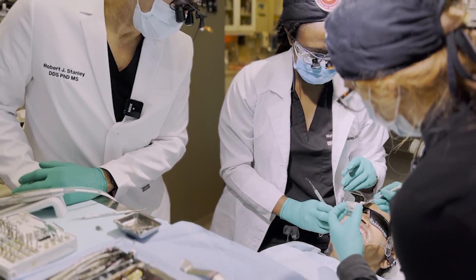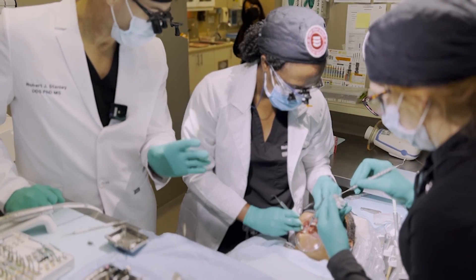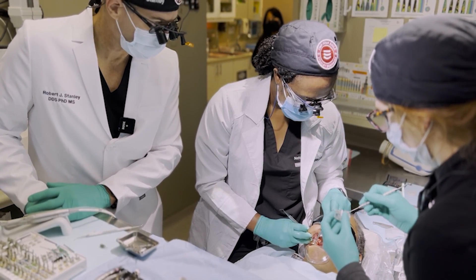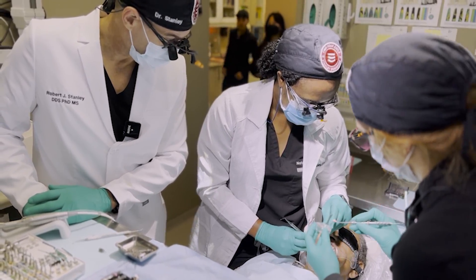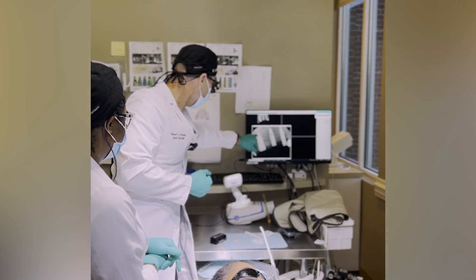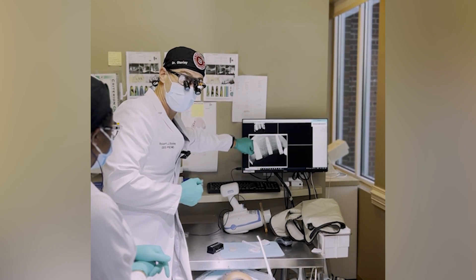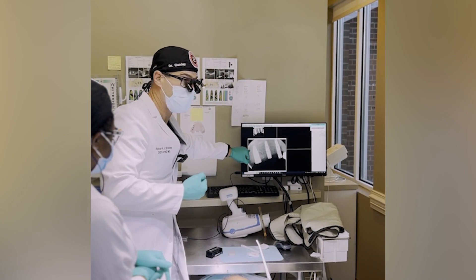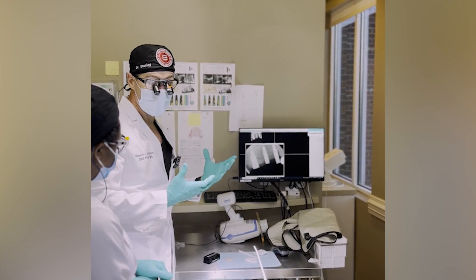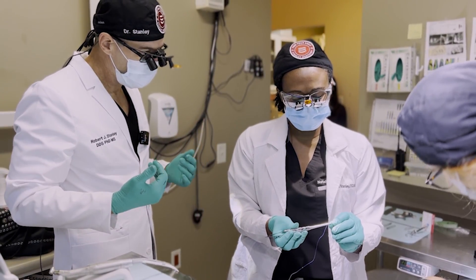All three implants are in right now — it's going great. For a molar with an implant going in, one cc is plenty of graft material. What we're looking at here is three perfectly parallel implants placed via a type 4 surgical guide. This one in particular used the five-thread rule to get this implant into the first extraction socket within a millimeter of the floor of the sinus — that's what we can predictably do every time with guided. And look how close we are to that natural tooth — a millimeter and a half away. That's what we can do with guided. Well done.